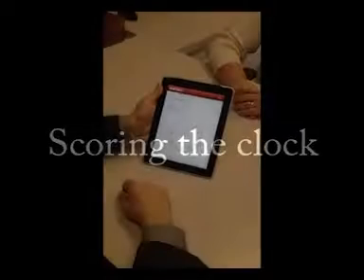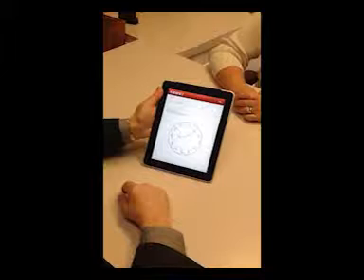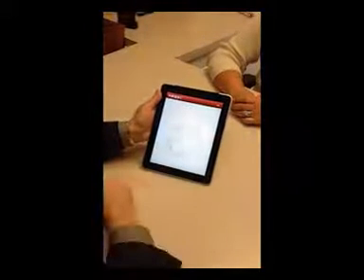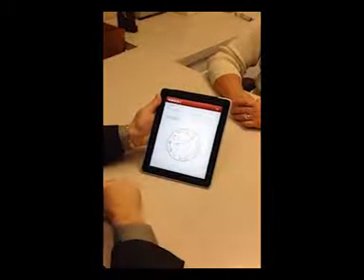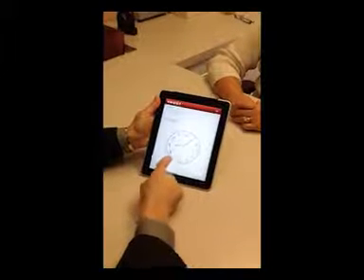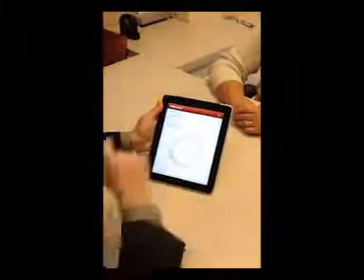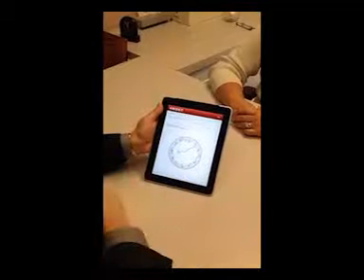Now I'm going to score the clock face through 8 specific steps. The first question is, are all the numbers present? As you see, they are. Are they in the correct order? And I'll look at that, and they are in fact. Are they spaced adequately? Are the 12, 3, 6, and 9 within each of these boxes? And making sure that none of the numbers takes the place of a different number. She passes that. Are they inside the face within this gray area?